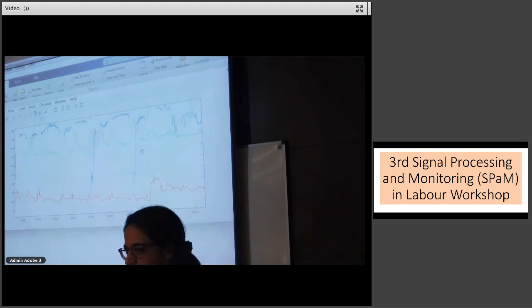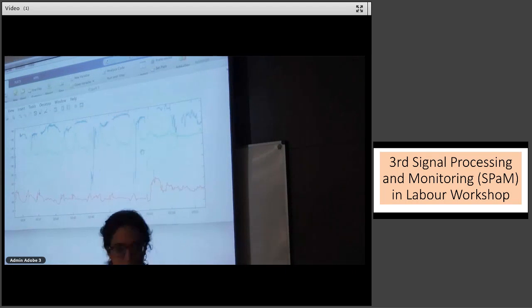So I accept that the terminology is widely used, but in certain contexts, it loses its meaning. And I think it's most meaningful for those babies where you look at it and it's like a sine wave. Yeah. That's the thing that should worry us. Otherwise, it's entertaining, it's academic, but I don't think it serves the purpose.